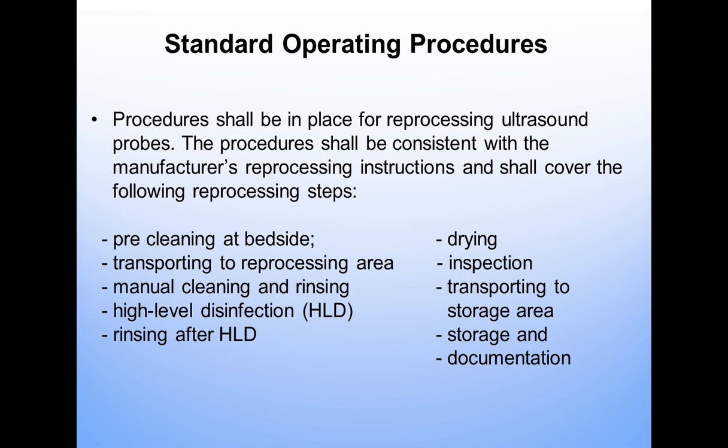And do you have standard operating procedures developed? I suggest that those of you who are working in the X-ray departments or diagnostic imaging departments, or even if you're in a private clinic somewhere, consult the infection prevention and control group. They can certainly help you develop your standard operating procedures. They shall be in place. That's new wording, that you shall have documents and procedures in place for reprocessing ultrasound probes. The procedures shall be consistent with the manufacturer's instructions for reprocessing, and also the CSA and all the other standards, of course, that we have in Canada.